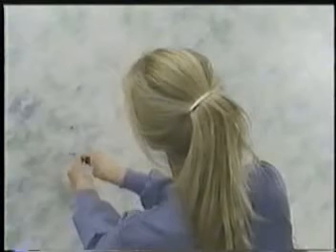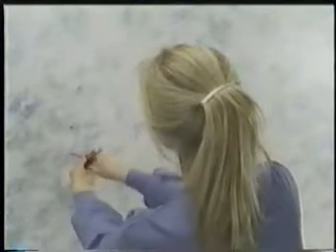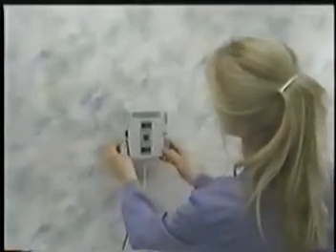If you decide to mount CCS on a wall, use the wall mount attachment. Select a wall in your operatory that is most convenient to the patient chair. Securely attach the wall mount to your selected location. Place the back side of the control unit into the wall mount and slide it down. The control unit is now secure. To remove, just lift the control unit upward and out from the wall mount. When the wall mount is in use, we do not recommend using the needle recapping station.